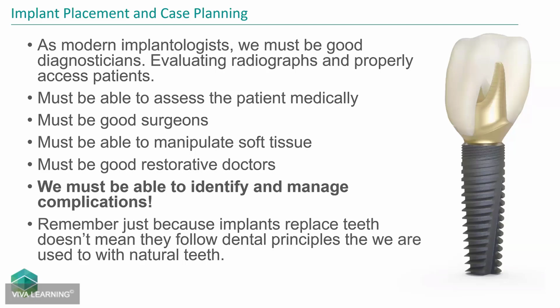Things like crown height, root to crown ratio, Ante's law. A lot of these things don't translate to implants. They follow their own set of rules. And even though they are replacing teeth, they don't follow the rules of teeth.